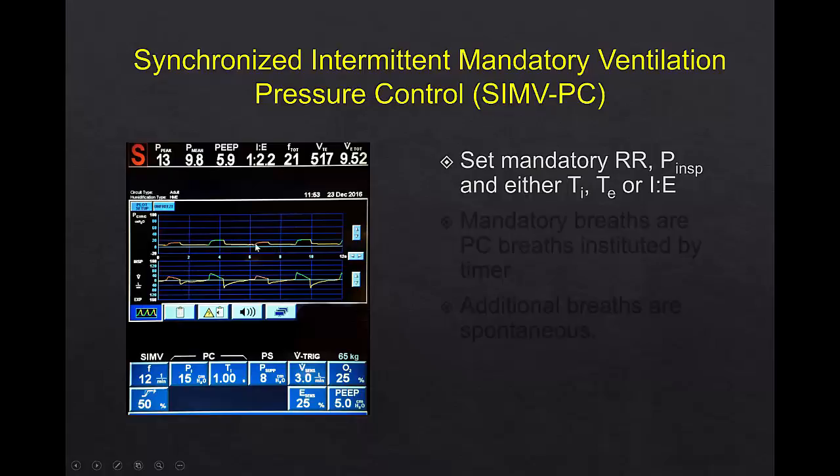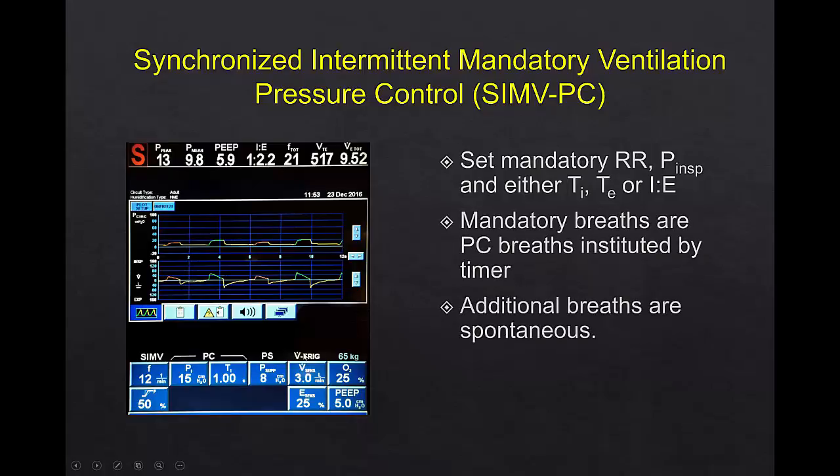During expiration, because it's IMV, the patient's breathing spontaneously, and in this case, the spontaneous breaths from a PEEP of 5 are supported with a pressure of 8. So when they breathe a red spontaneous, it goes from 5 to 13, which is what was picked up on the machine. Spontaneous breath hit 13. If this had said a mandatory breath, it would have hit, what is it? It would have hit 20, 5 plus 15.